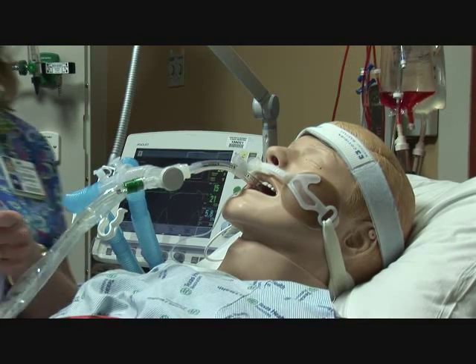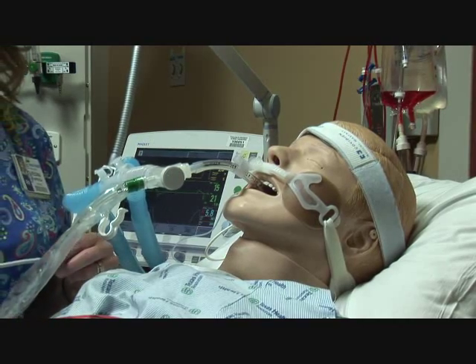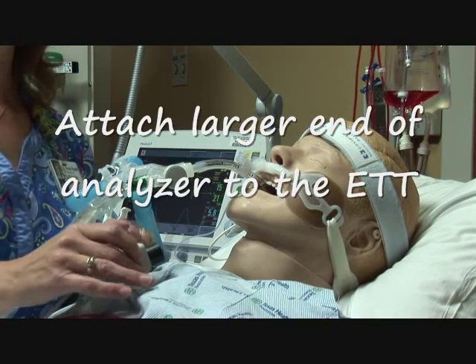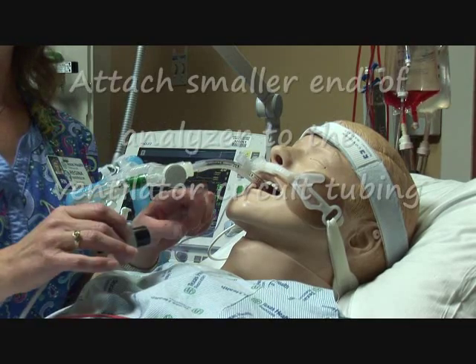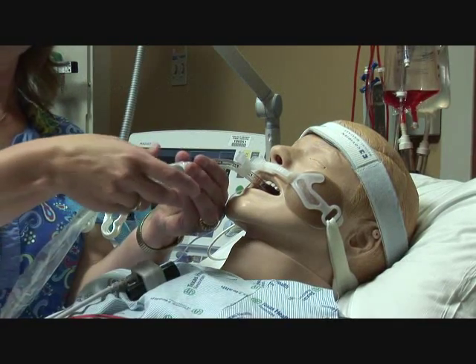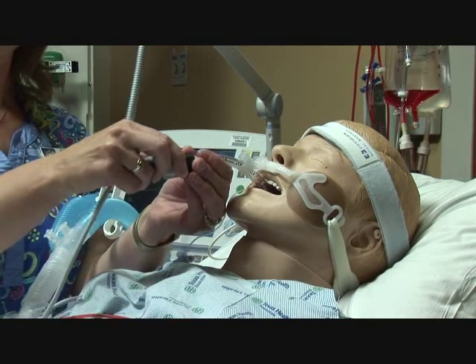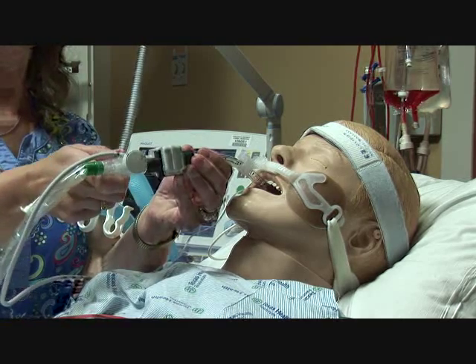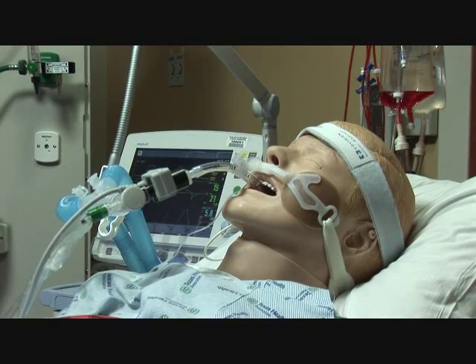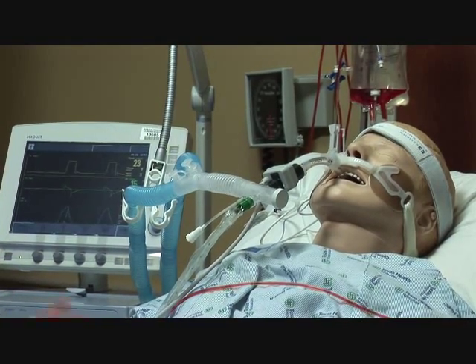Now we're going to attach the analyzer to the ET tube and ventilator. You want to make sure that you have it all ready to go so we don't lose any ventilation. You would attach the larger tube to the ET tube and the smaller tube to the circuit. So you want to hold on to the ET tube for security and detach, and then hook the larger tube up and the smaller tube to the circuit. And then you're ready to analyze. Travis, do you have any questions about how to hook that up? No.